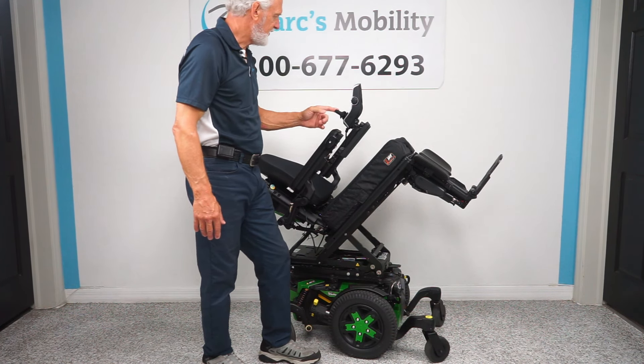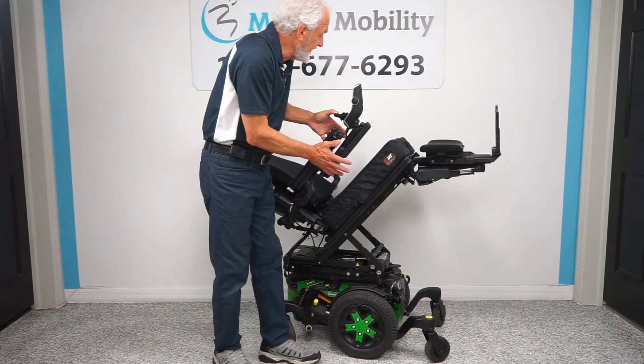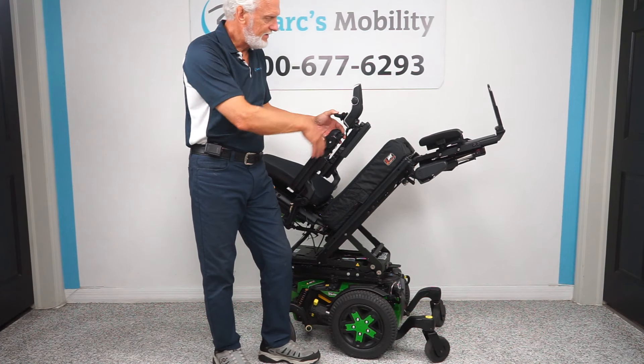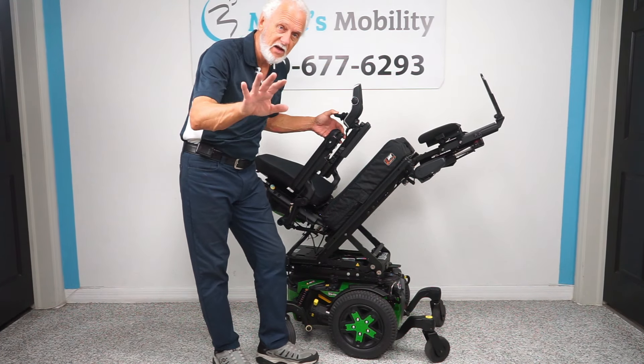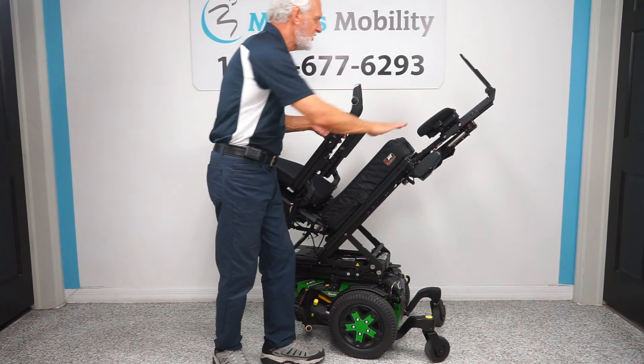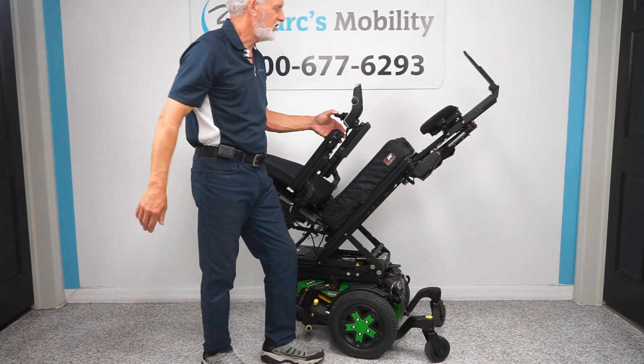Now I'm going to show you just the feet. Remember, we can adjust these seats — so if you're five feet tall, five-eight, five-four, or six foot and skinny, you can still use this chair. We can adjust the seat depth and everything on this chair to fit your body size. That's a little extreme, but if you need some circulation you can see how you can do it.